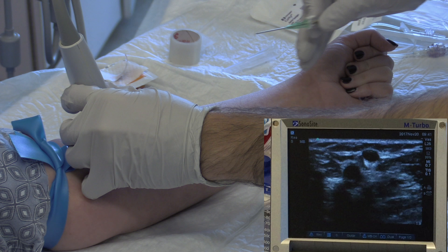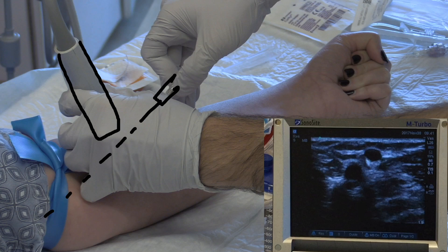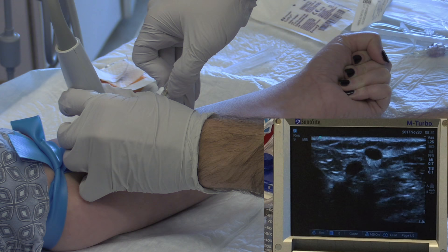Clean the target area. In one hand, use the vascular probe to image the target vessel; in the other hand, position your IV catheter. The key to insertion is visualizing the angle between the ultrasound beam and the needle — you can only properly visualize the needle tip at the intersection of these two lines. It's important to puncture the skin slightly distal to your probe, keep the vessel in the center of your ultrasound screen, and puncture the skin directly in the center of your ultrasound probe. Your needle direction should be based on the course of your target vessel.